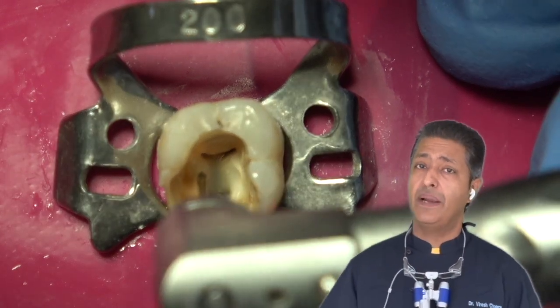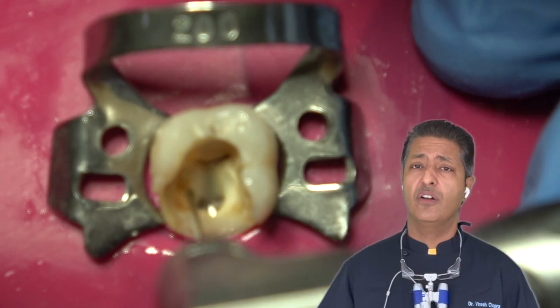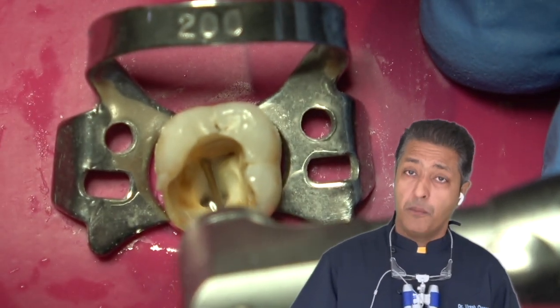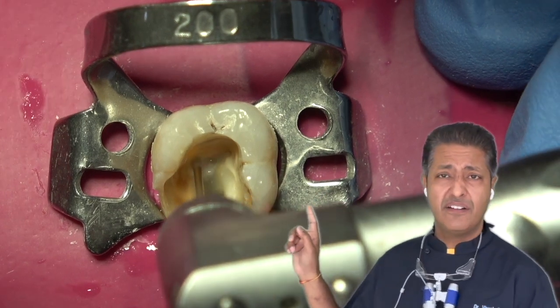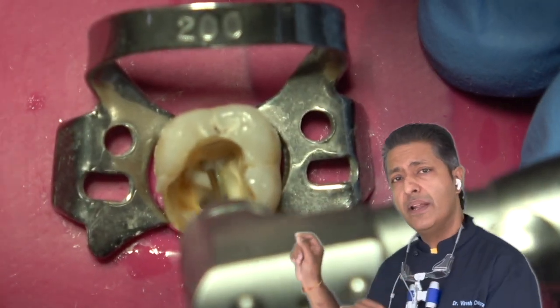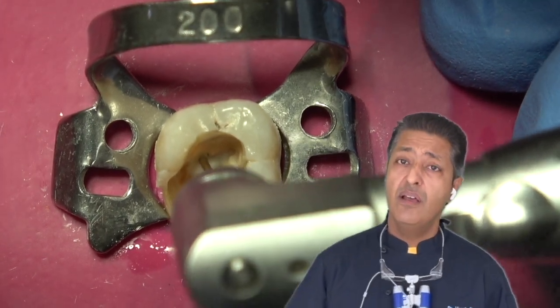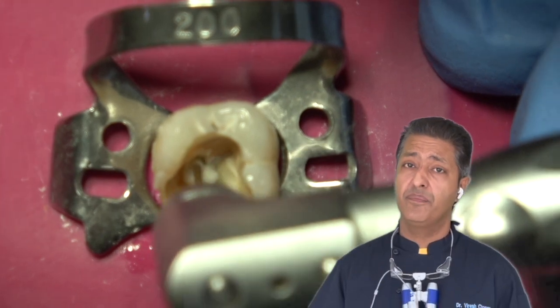If we are not using any rotary endodontic file system, then we can go back to the traditional way of orifice widening, which is the use of Gates Glidden drill, as you can see on the screen here. Only taking care that we choose the correct size of Gates Glidden drill. We are not doing any outward to inside brushing movements. We are not forcing the Gates Glidden drill inside the canal.